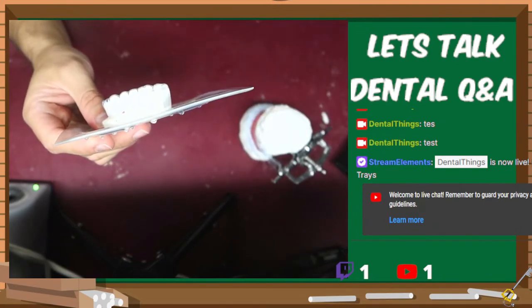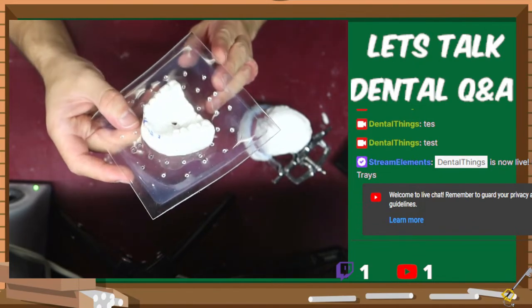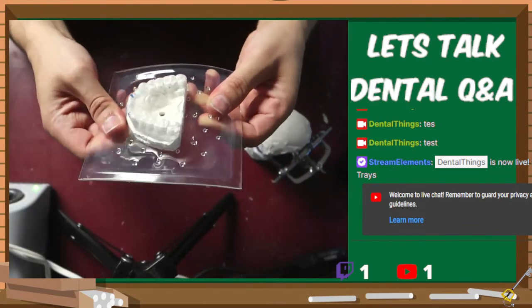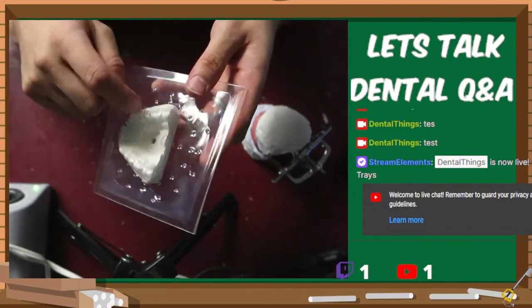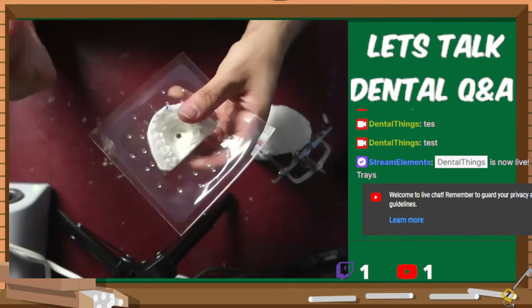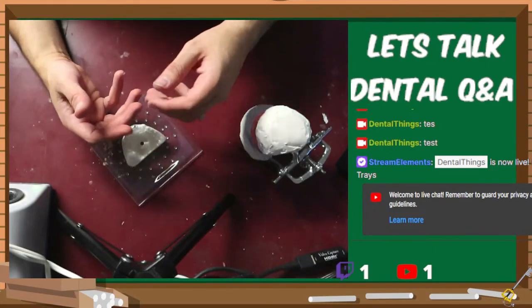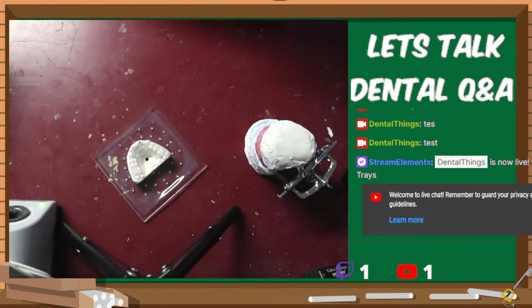Now, I know this one doesn't have that great of focus when I do stuff like this, and it's also super bright. Actually, if I turn this off, it might make it a little bit nicer. But now I got a nice mold of my model, my little plaster model. So I'm just going to go and rip this off and cut it so it matches the teeth a little bit better. But that's called a vacuum former. It's nothing too special, though.